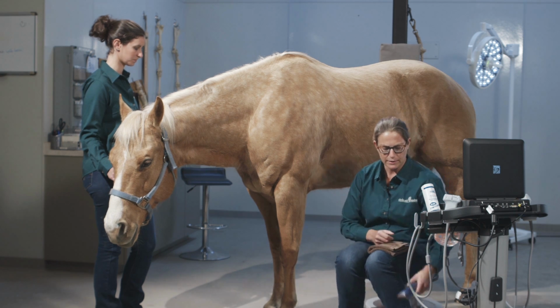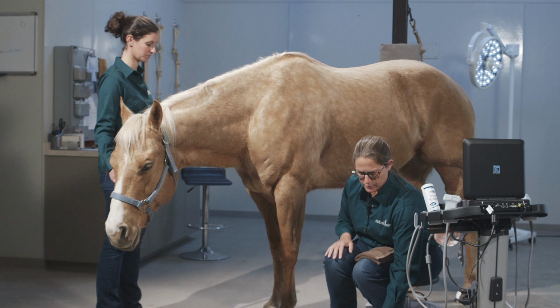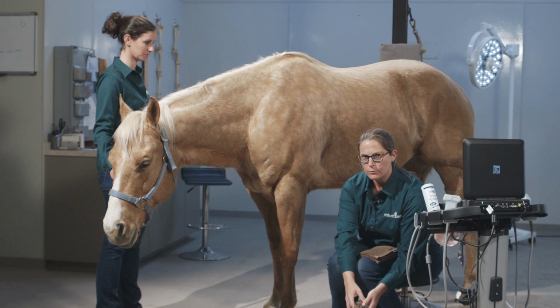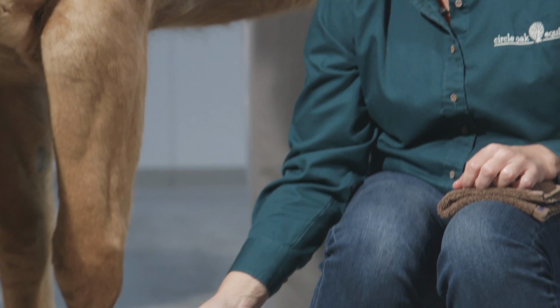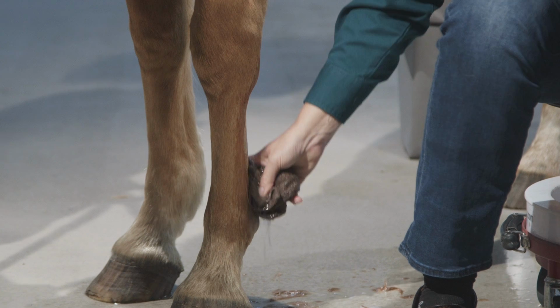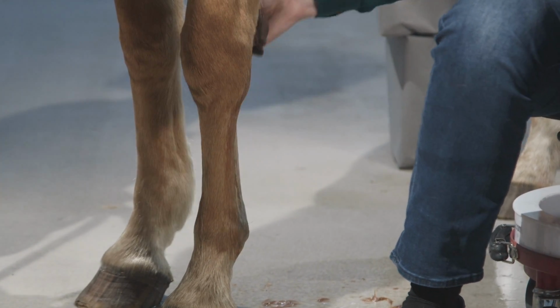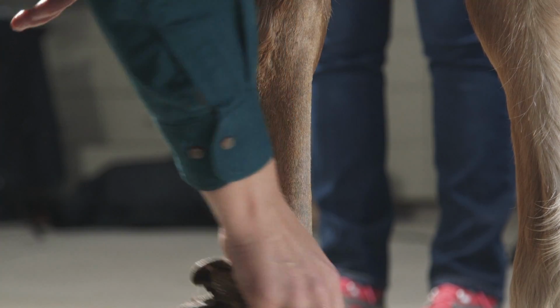So once we've gone ahead and clipped, then the next goal is to get the area as clean as we can, to get as much debris and dirt off the area as is possible. So again, I'm going to scrub using warm water, a little bit of dilute chlorhexidine soap and solution, and a rag to go ahead and clean the area as best as possible. Again, I like to scrub not only the area that I've clipped, but the area surrounding it so that the dirt doesn't bleed into my ultrasound location and decrease the image quality.